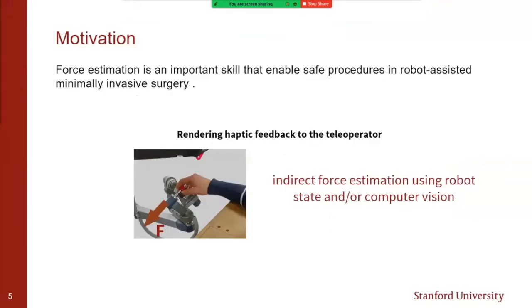Force estimation is an important skill for performing safe procedures in robot-assisted minimally invasive surgery. One way we can easily do this is to render haptic feedback for the surgeon. And indirect force estimation through data streams such as robot state or endoscopic images is one such method for deriving the forces that we can display to the surgeon.